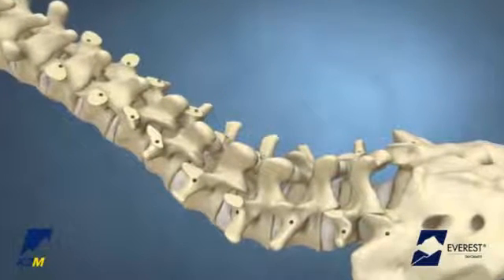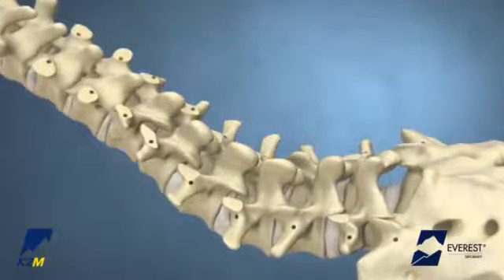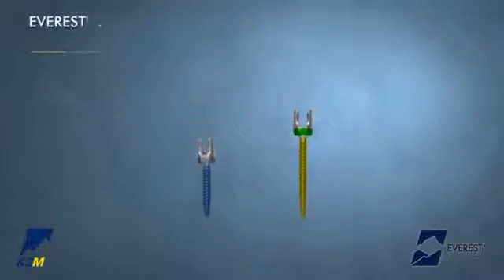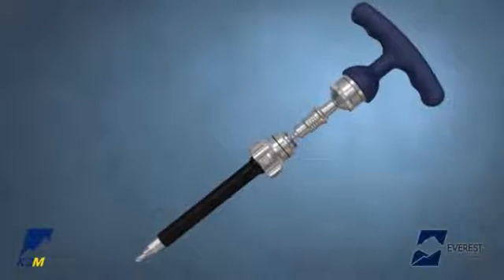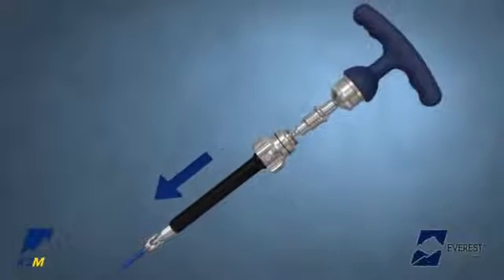After the pedicle pathway has been prepared and proper screw length and diameter have been determined, select the appropriate implant and load the Everest Deformity Screw Inserter. The inserter will work with both polyaxial and uniplanar Everest screws. To load the inserter, grasp the implant by the shaft of the screw and apply a downward force to engage the screw into the hexalobe fitting of the screw inserter shaft.